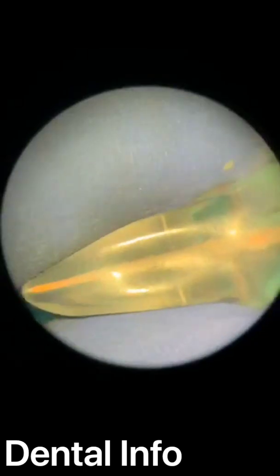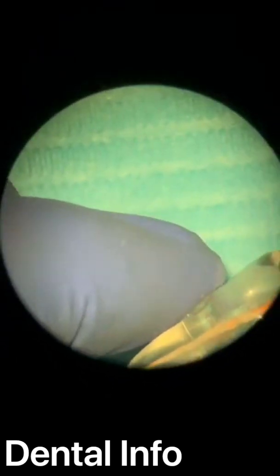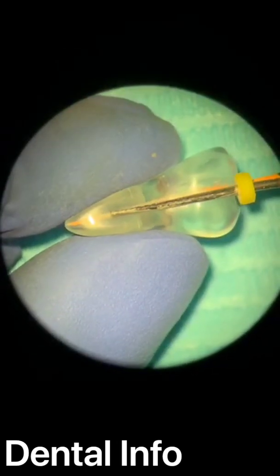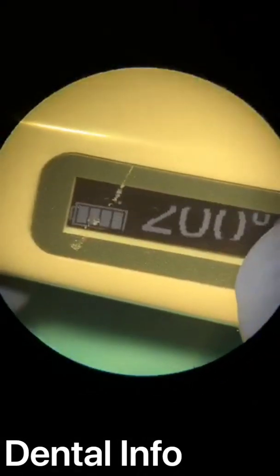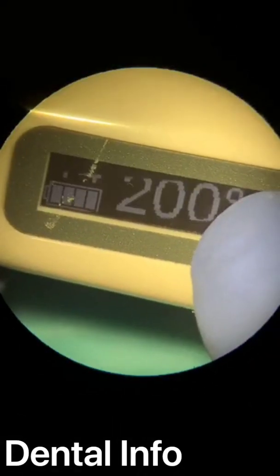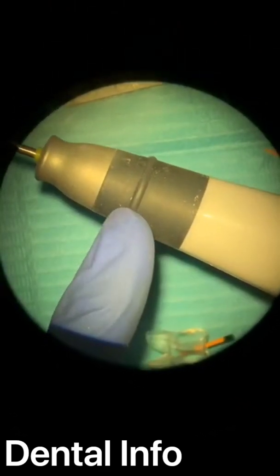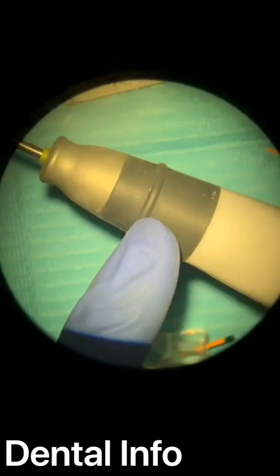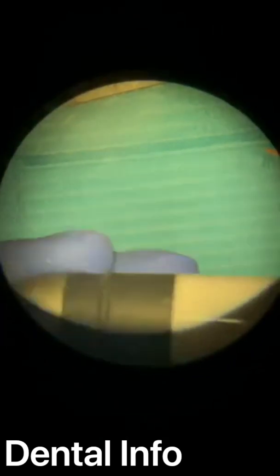Now we will go and cut it out. As I told you, I make the fit. I will cut over here. I'm switching it on to 200 degrees. What I like the most here, look, this is the activation button. All this ring is a button, okay?